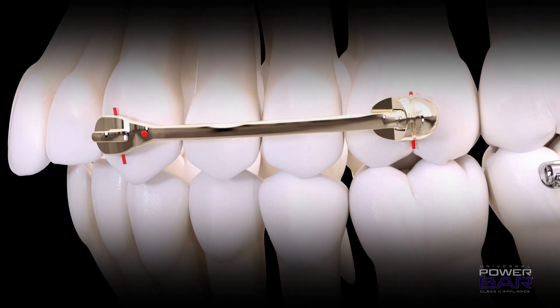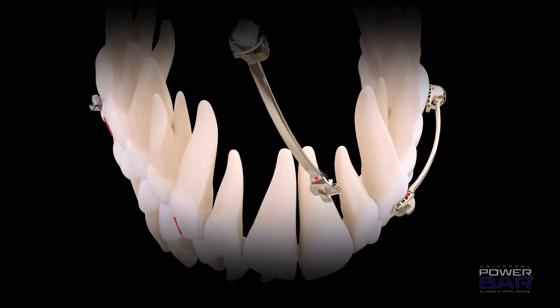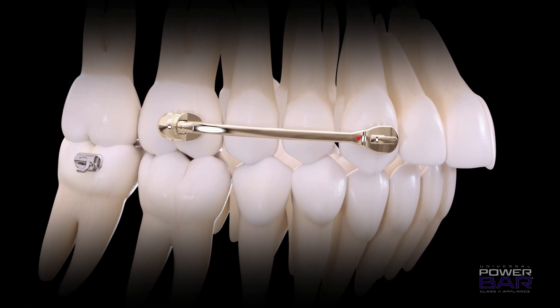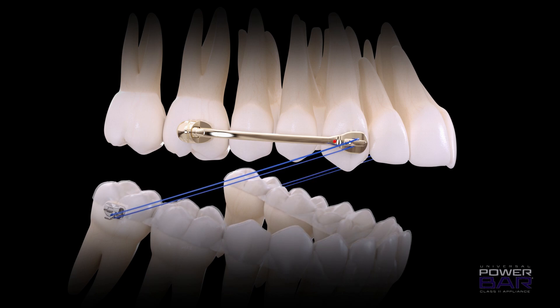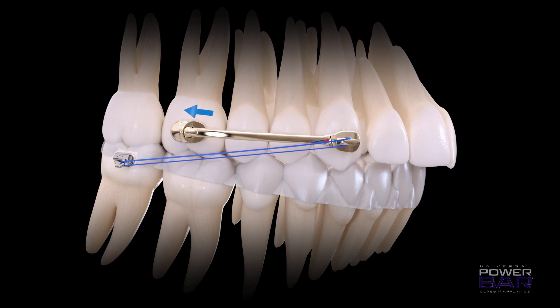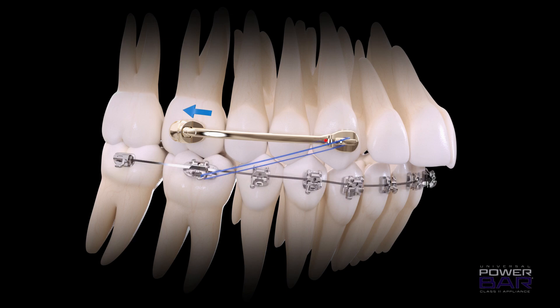After bonding tubes, buttons, or the equivalent to the lower arch first or second molars, the correct size Universal Power Bar — which is measured from buccal groove to the mesial third of the canine or premolar — is placed in the upper arch. The lower arch is typically anchored with an 0-4-0 aligner material. After the first month or so, braces on the lower arch can also be incorporated.